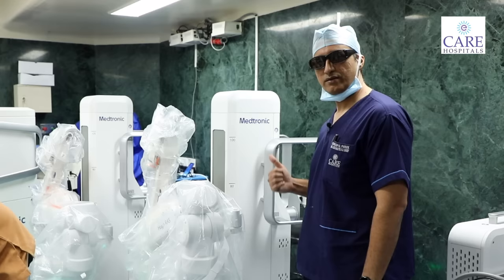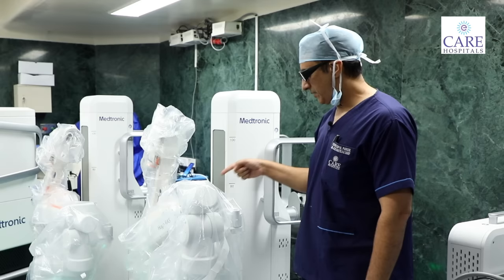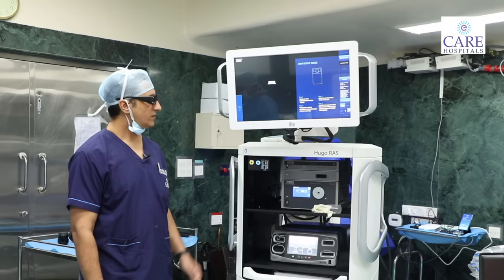Now the other important part of robotic surgery is the arm consoles. So we have four arm consoles. Each weighs around 250 kgs and is made up of titanium. This arm has multiple levers along which the movement happens inside the patient's body. So if you see, this is the Medtronic Hugo RAS system, and when it moves, it creates very fine movements inside the patient's body. It's made up of titanium and we have 1, 2, 3, and 4 arms pertaining to this.